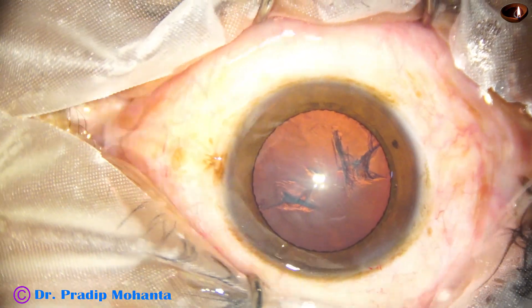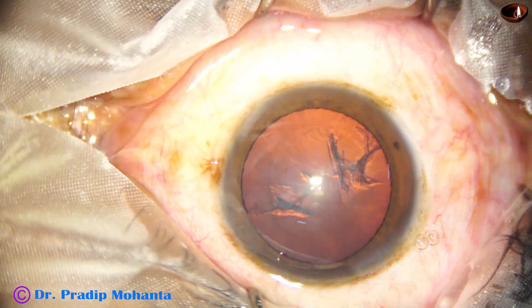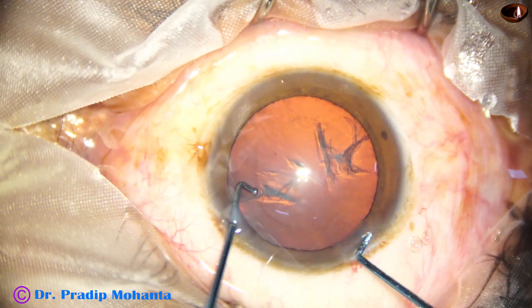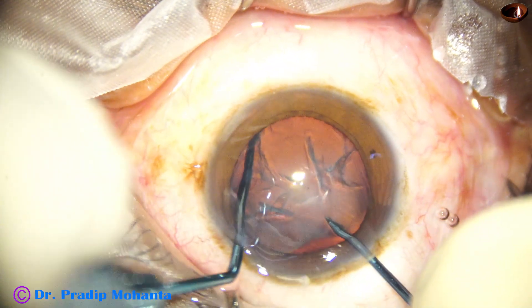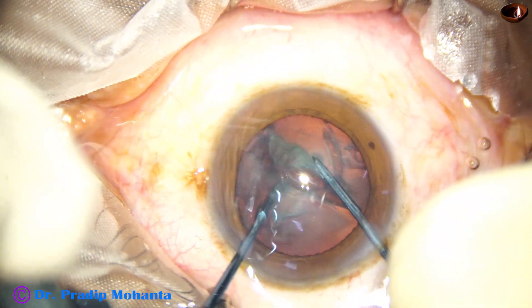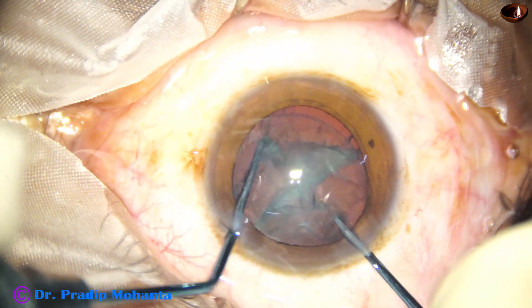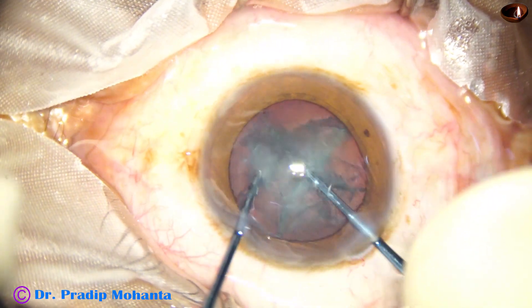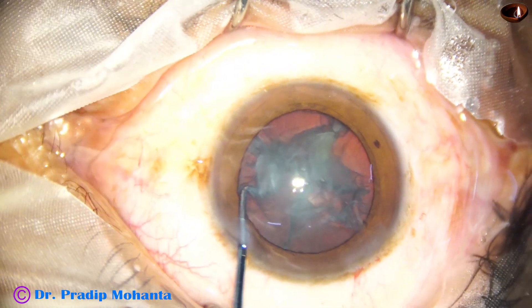And now the anterior chamber is again filled up with viscoelastic. Now I take the pre-chopper designed by me and the nucleus sustainer and divide this nucleus into 2 hemi-nuclei. This is real time. Now I rotate this nucleus and 90 degrees away do another pre-chop and we get 4 pieces.